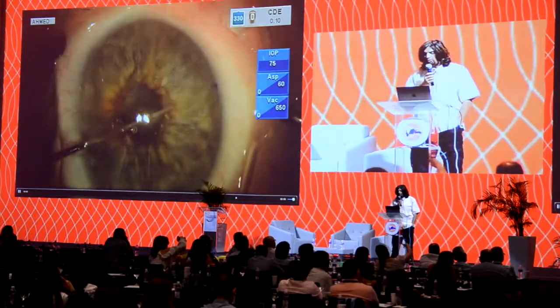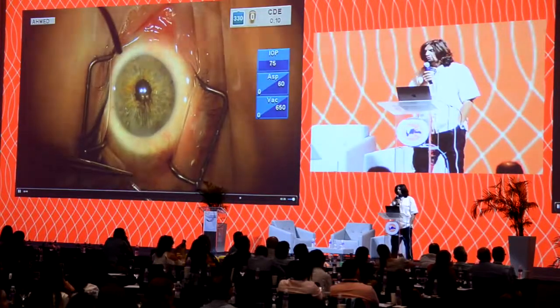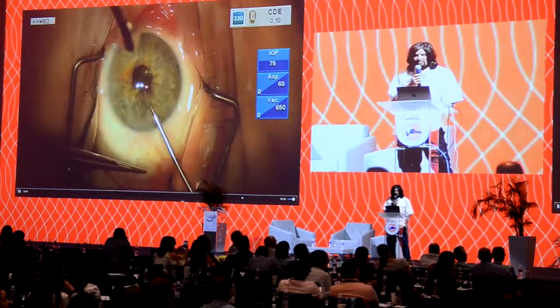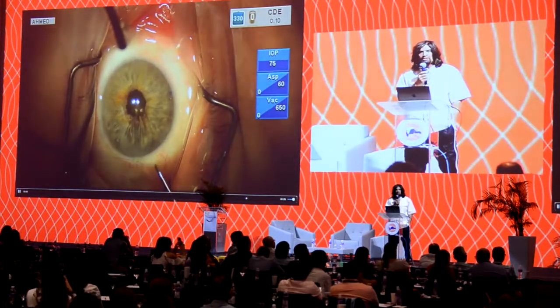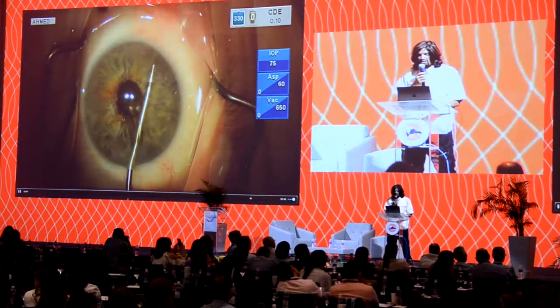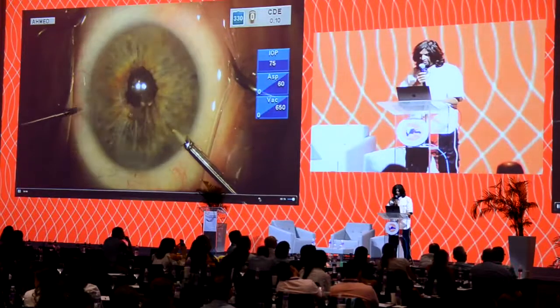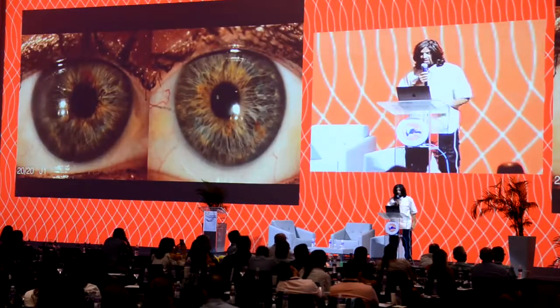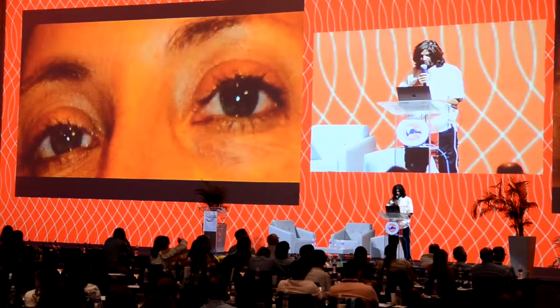And here we can get the pupil down to a reasonable size. I like to try to get close to what we have in the fellow eye, not smaller than 3.5 millimeters, but about that size to match the fellow eye. Again, we realize the pupil will not dilate in the dark or pharmacologically. And this is her appearance post-operatively. She was quite pleased with that result.